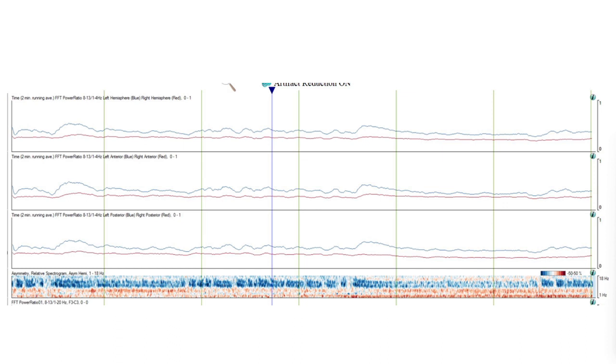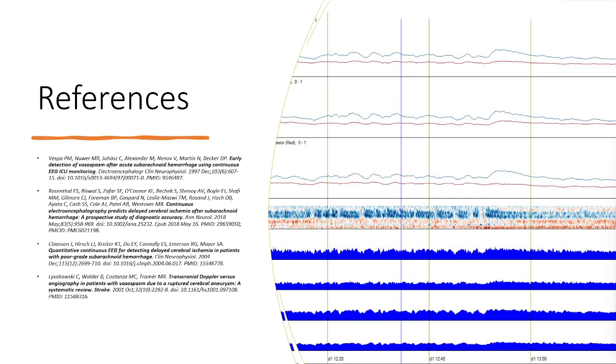Rosenthal et al. utilized a more easily applicable simple visual analysis of the ADR graphs instead of relying on real-time mathematical calculations. When used in conjunction with other EEG alarms including new epileptiform discharges, new focal slowing, and relative alpha variability, the study predicted DCI in lower-risk patients with 91% sensitivity and 83% specificity, and in higher-risk patients with 95% sensitivity and 83% specificity.